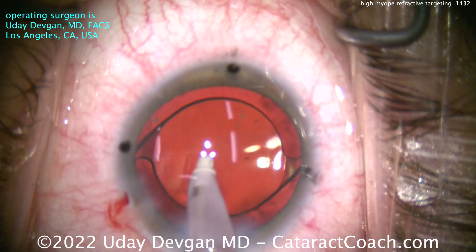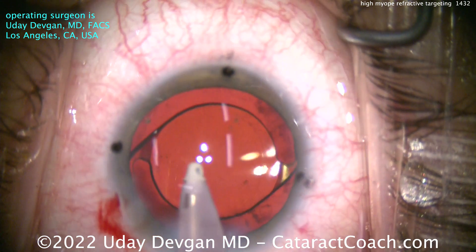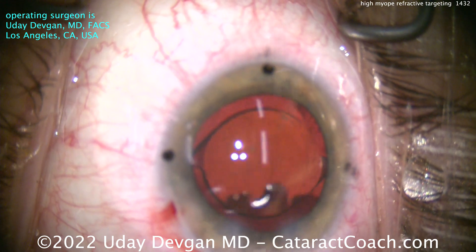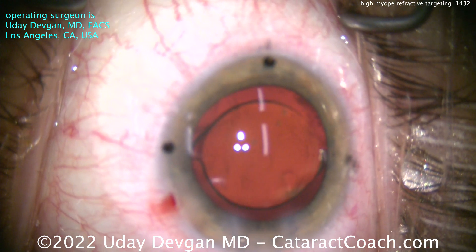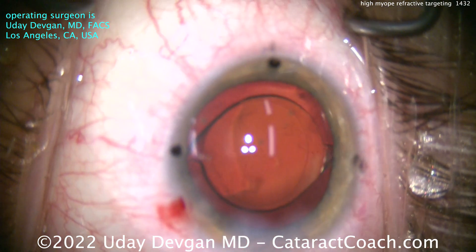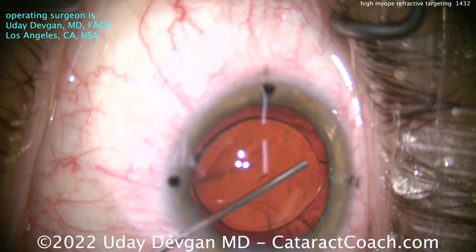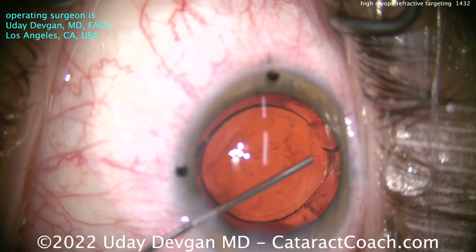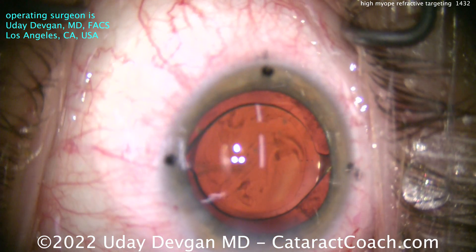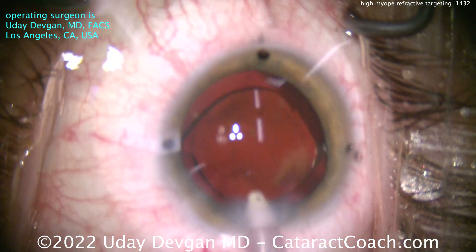In this case, it's more about getting accurate biometry ahead of time, along with the limitations of our calculation methods. Here at the end of the case, we've got a toric lens in good position, and you can see there's a good overlap of that optic by the capsulorhexis. For this patient, we're able to fix the preexisting corneal astigmatism, correct 90% of the preexisting myopia, and aim for a post-op refractive outcome of about minus 1.5 — correcting 90% of the patient's myopia at the time of surgery.